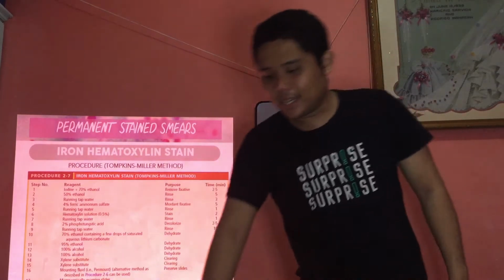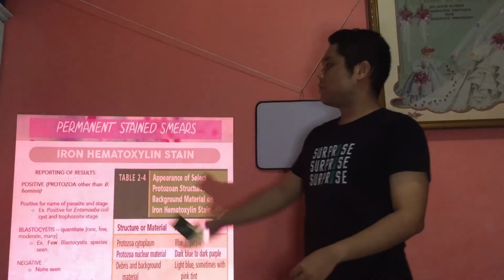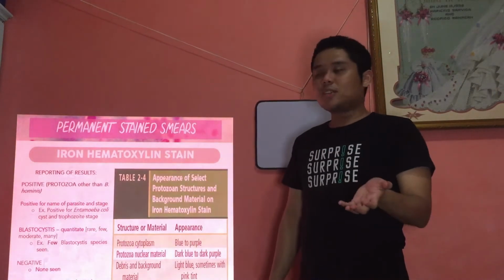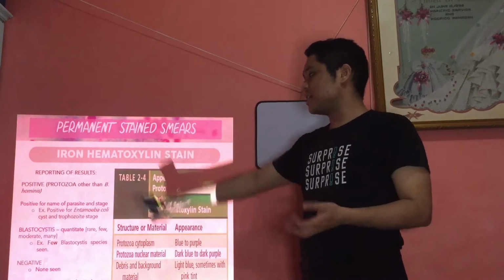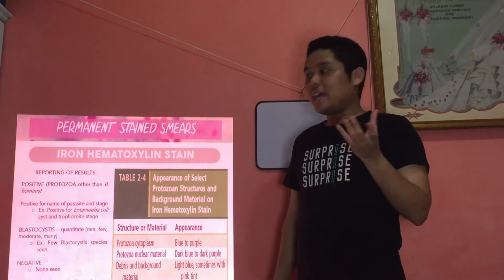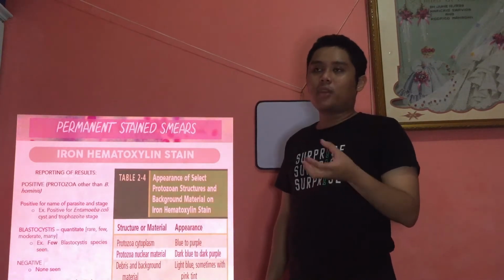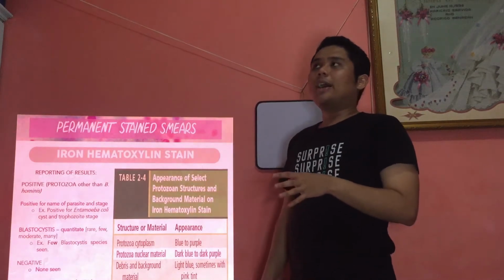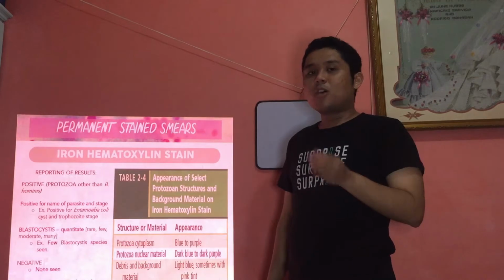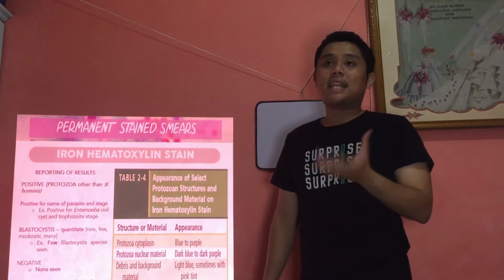Okay, all right, and now we go to the expected results of iron hematoxylin. This is how we report it. For positive, other than Blastocystis hominis, we say positive for the name of the parasite and its stage. Example, positive for Entamoeba coli, cyst, and trophozoite. For Blastocystis hominis, we quantitate. So it's either rare, few, moderate, or many. It was not stipulated how many is rare, few, moderate, many, but it's established per laboratory.